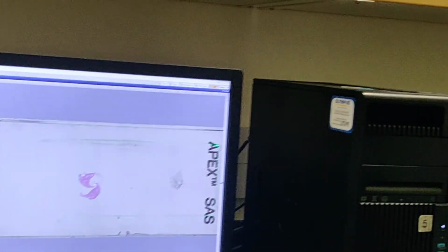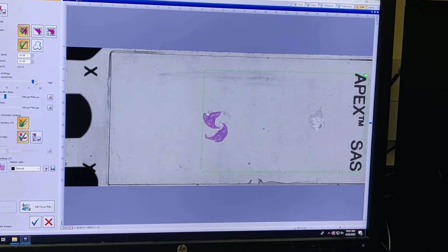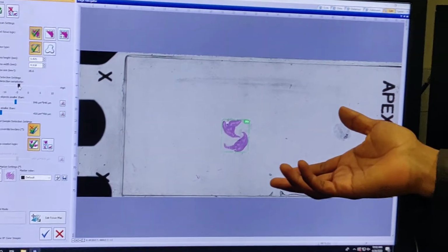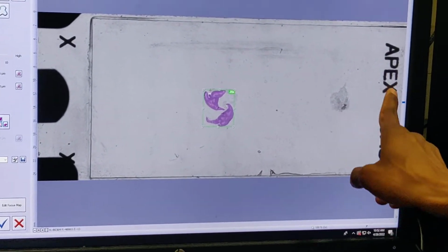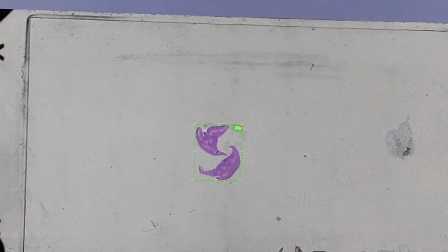Okay, so you can use these parameters here to basically adjust the sensitivity of this. Ideally, it should be able to capture only the object here. Now it is picking only the object. You can see that, which is amazing, that your contrast is so good and you're not picking up background and random things. So I can use this setup for imaging everything.